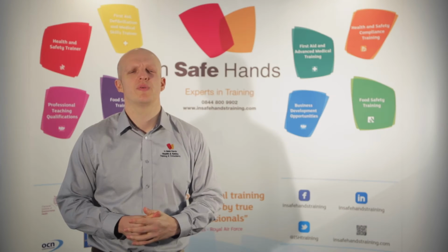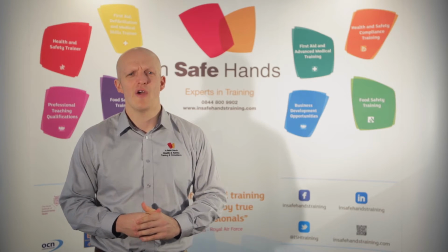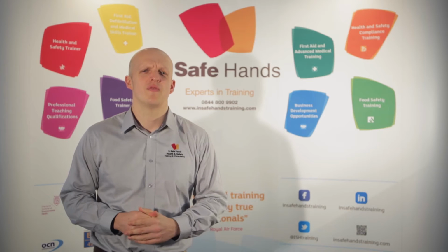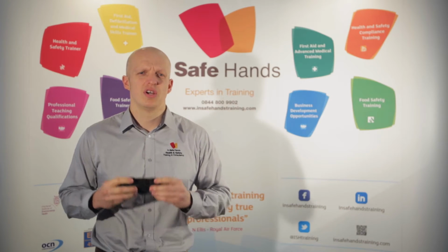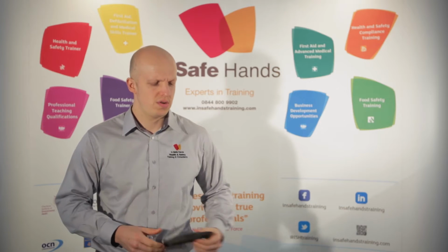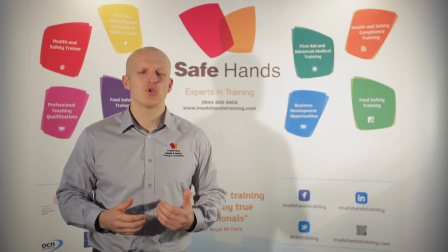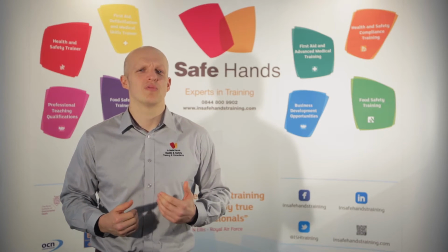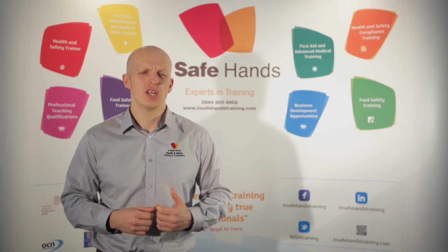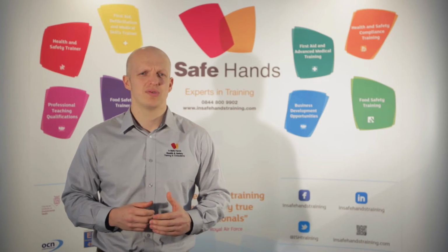So you recall from your first person on scene training that catastrophic bleeding takes precedence over everything else within the primary survey. Some vital ingredients to managing catastrophic bleeding will include combat application tourniquet, emergency bandage and hemostatic agents. Catastrophic bleeding is bleeding that, if not controlled, is likely to cause a fatality. So primarily we're looking at stopping that bleeding prior to doing anything else.